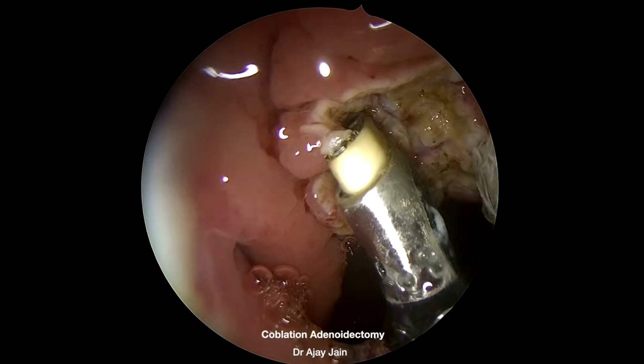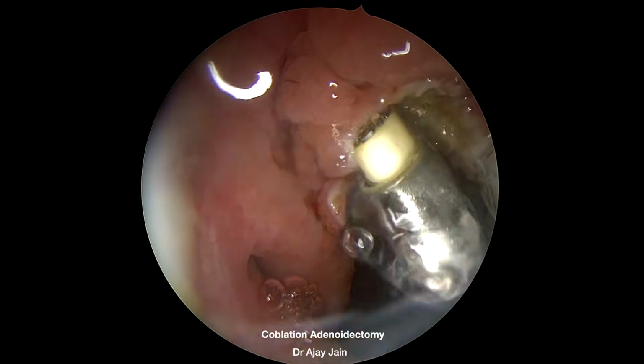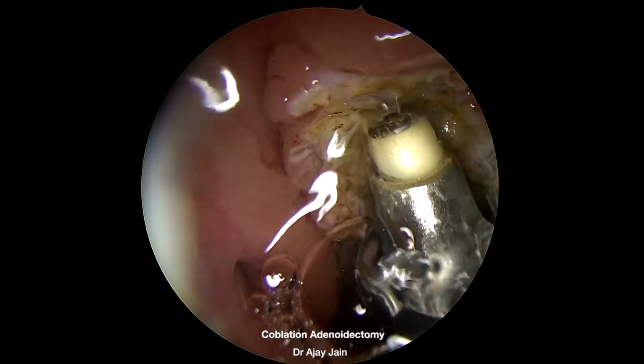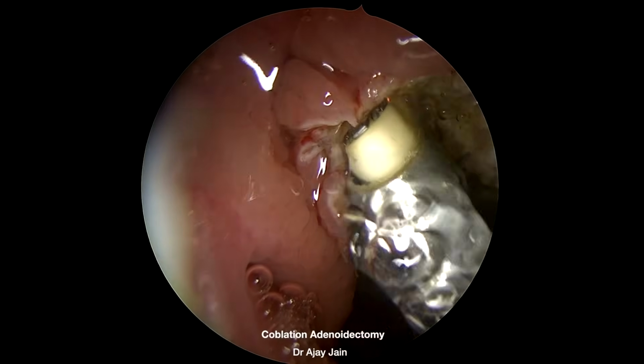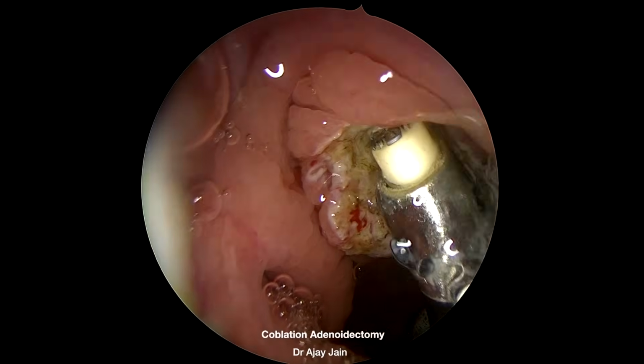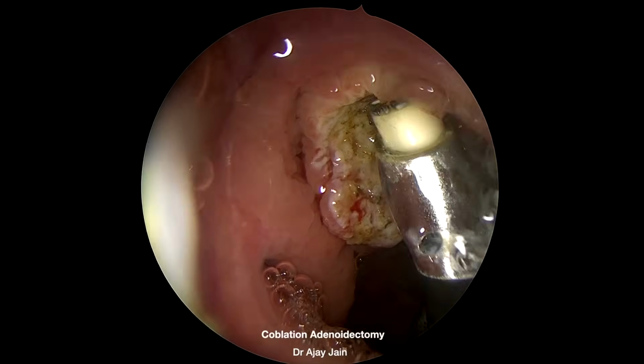Particular attention is paid while dissecting the adenoid tissue from the posterior lip of the eustachian tube. This is a critical step. Excessive cautery or rough dissection in this region should be avoided because postoperative scarring around the tubal cushion may impair eustachian tube function.